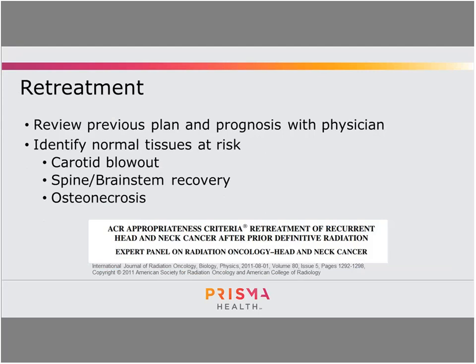Retreatment is something we don't see that often, but when you do see it, you kind of scratch your head and say, what do I do? Because now you're looking at doses going over 100 gray. You start to wonder what that means. And I think one of the most important things is to review the previous plan and prognosis with the physician.